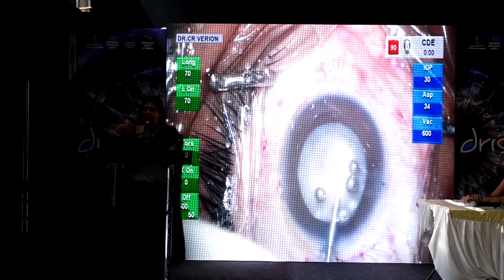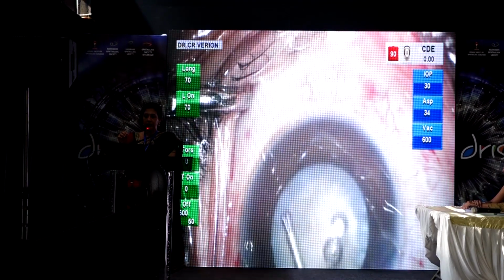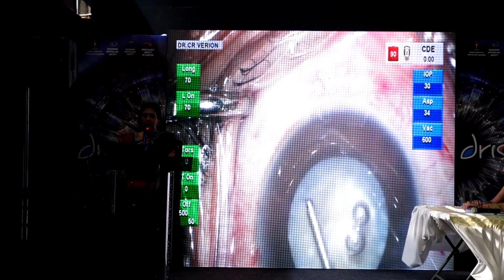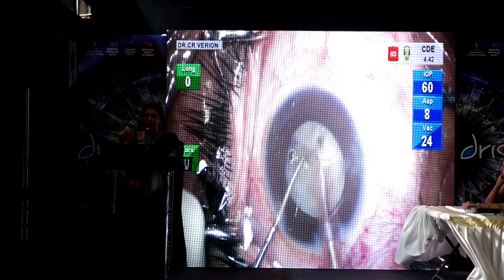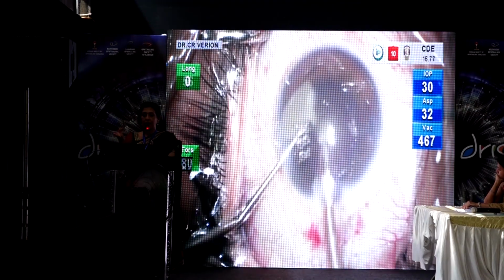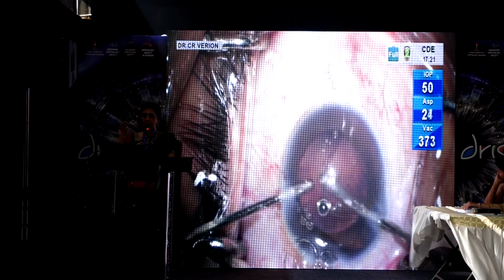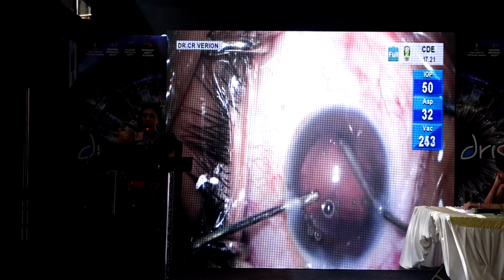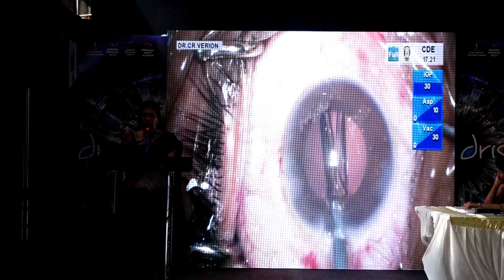But as I'm just trying to inject viscoelastic, I see that small tag which is there, which it is important to remove, to make it an entirely smooth rhexis, because these could become the weak points for a rhexis extension. Then, of course, in these total cataracts, there is no nuclear fragmentation because it's a totally white opaque cataract, and you have to do your manual approach, and then it just becomes a routine surgery.